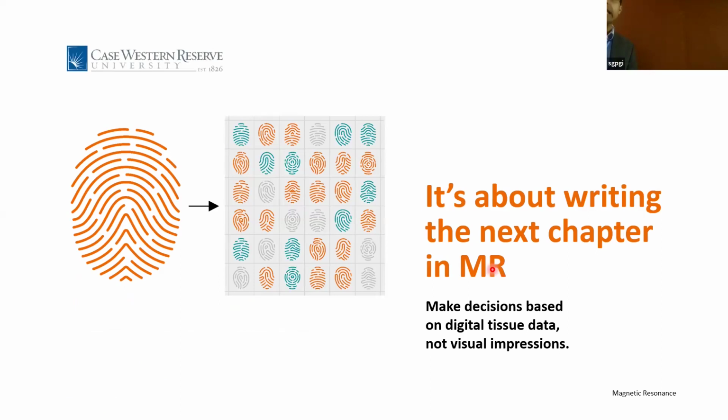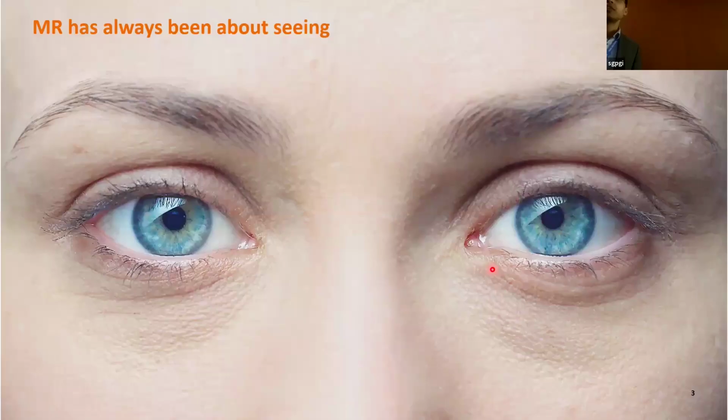So what is fingerprinting? It is basically what can be termed the next kind of quantification technology, how you can do quantification in a better manner in MRI. So usually in MR, when we talk about MR imaging, we are talking about qualitative imaging. So we are basically seeing certain images. We are qualitatively assessing certain properties of the image. And based on that, basically we are making a diagnosis.